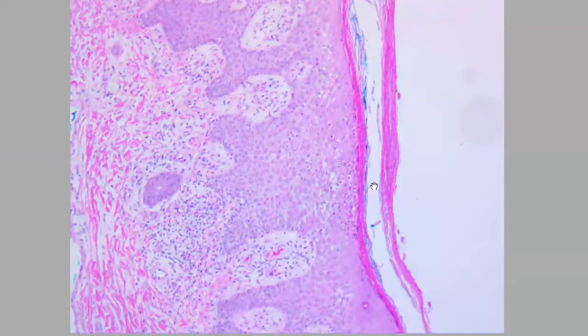Another key feature is the parakeratosis, and I'm not sure if from this power you can see these small blue dots, but we'll go on a higher power to appreciate this. And beneath the parakeratosis and these neutrophils, you will have thinning of the granular layer, which we call hypogranulosis. So here you can find this granular layer more evident, but here it will disappear. So this is another feature. Let's go at a higher power and see these features better.